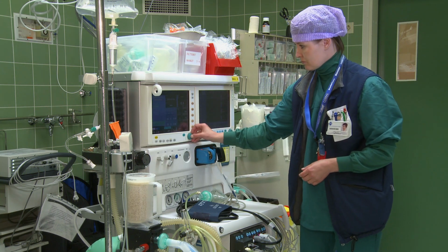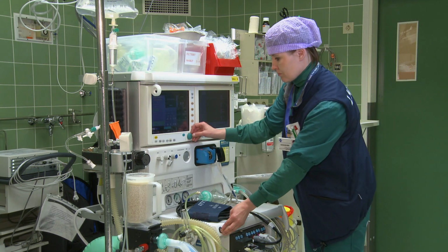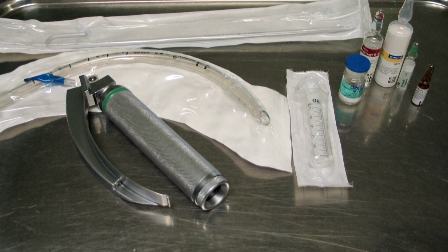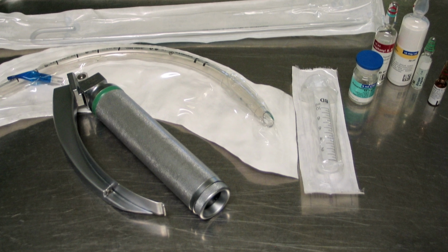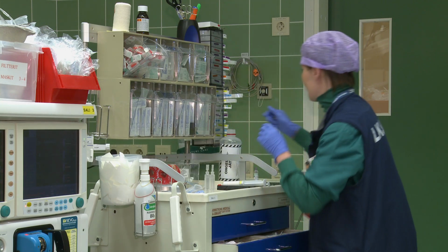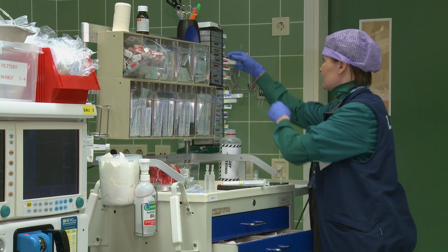The nurse sets everything up before the patient arrives in the operating theatre. The spinal anaesthesia pack is opened, and equipment for general anaesthesia is also set up ready as a precaution. The nurse draws up all the necessary drugs into syringes.